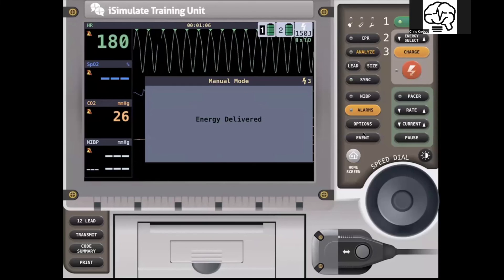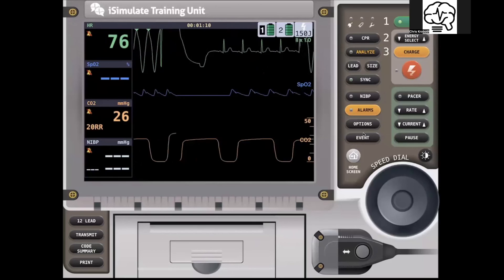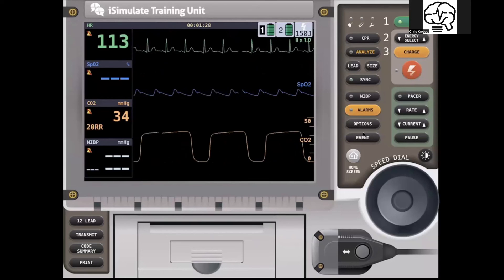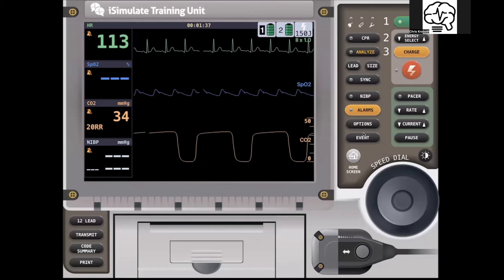Not cardioverting on the R wave can be a problem — that's where you can get R-on-T. So that's what it looks like on the LifePack 15: it's not that nice in-your-face dashboard that the 35 provides.